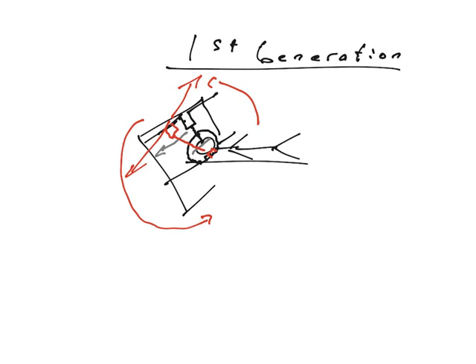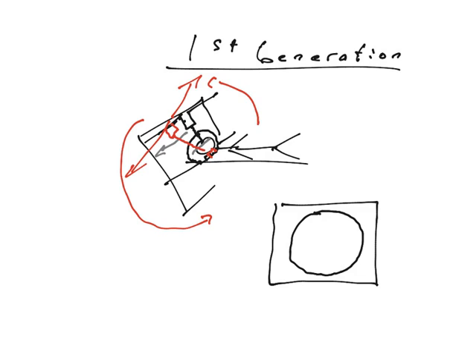And so if you had kind of a front-facing view, it looks like this. Here's the machine. Here's the track, the little X-ray source and the detector. And here's the hole where the head would be placed in.